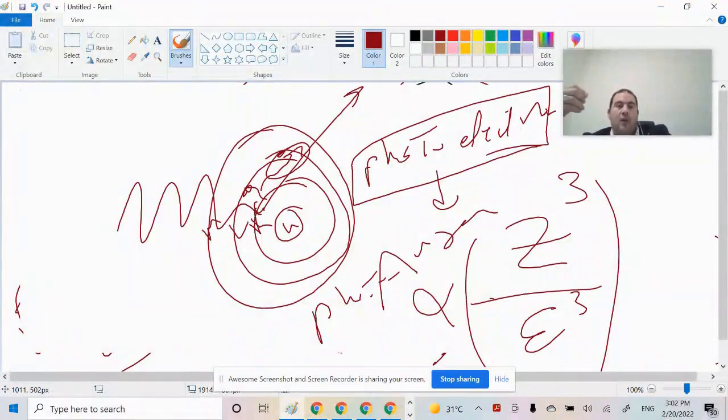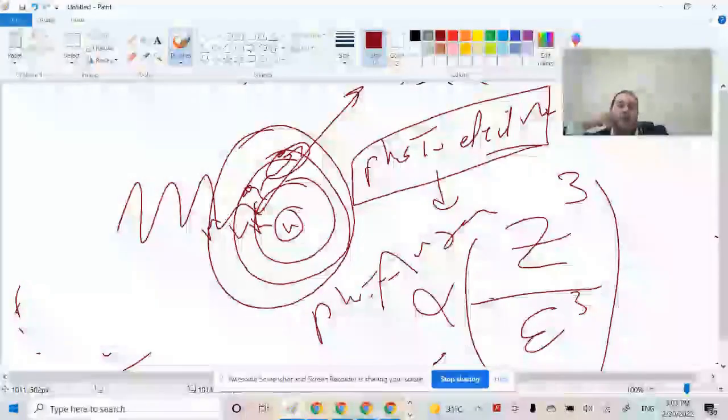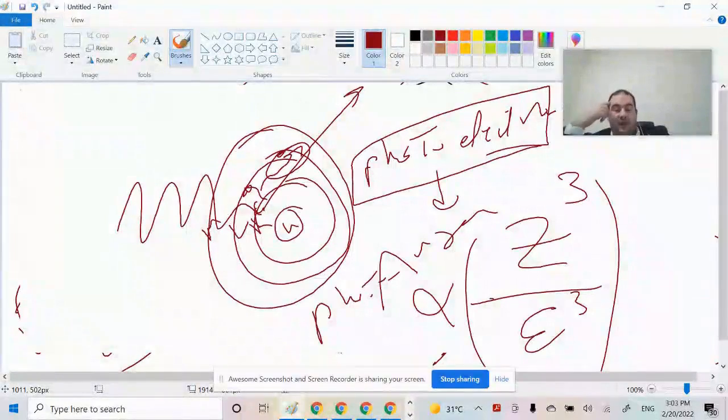This causes what we were talking about, the distortion, or it reduces the contrast present in the image of the film. On the other hand, low energy increases the side scatter compared to the forward scatter.